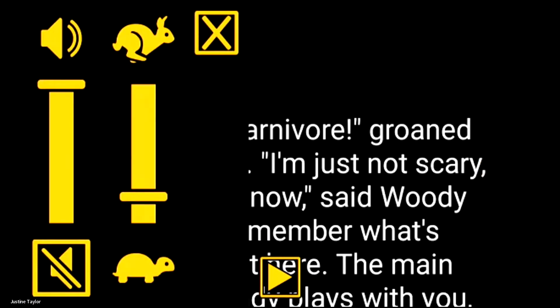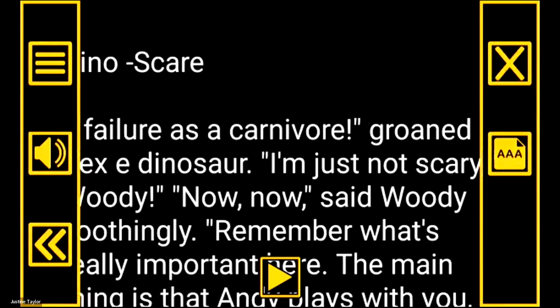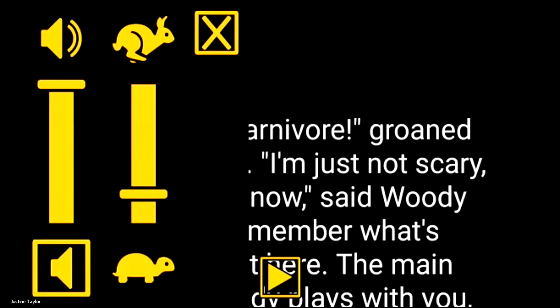We've got the mute button there. You can see that you're adjusting your volume, and then for speech rate, you've got a little turtle or hare. Slide up to increase speech rate. I have my spoken menus on, so it tells me if I slide this bar up, it's going to increase the speech rate, and if I go down, it's going to slow it down.